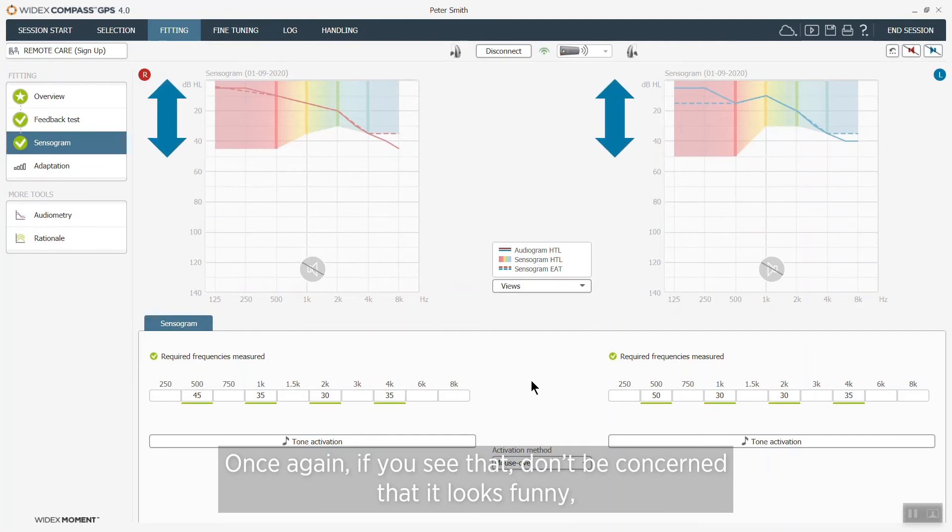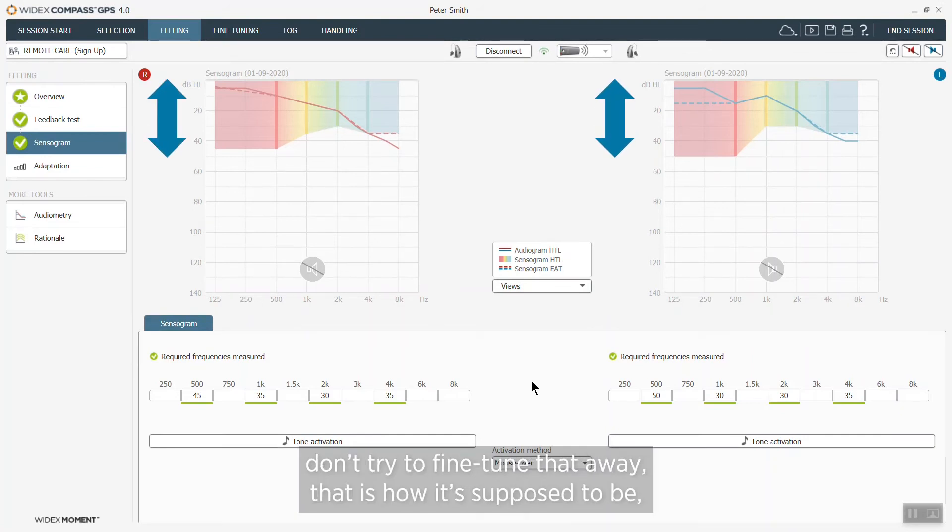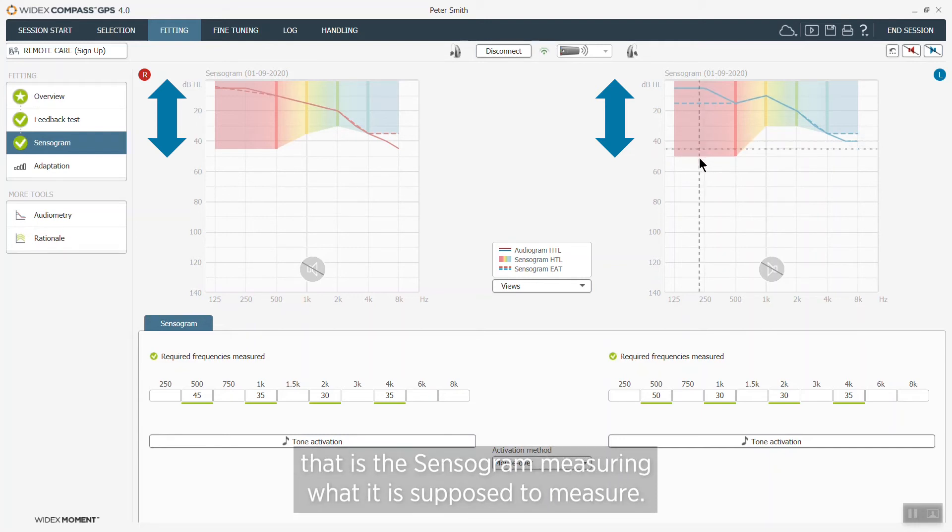So once again, if you see that, don't be concerned that it looks funny — don't try to fine tune that away. That is how it is supposed to be; that's the sensorgram measuring what it is supposed to measure.